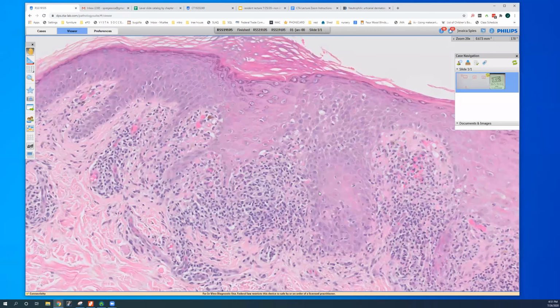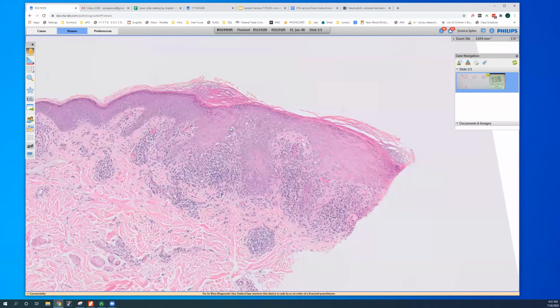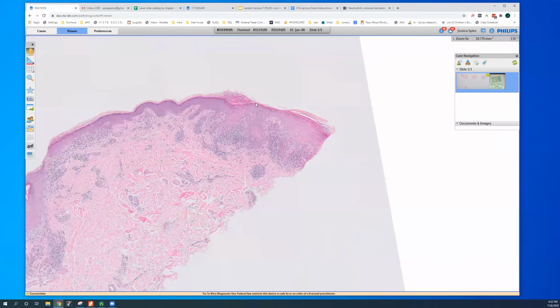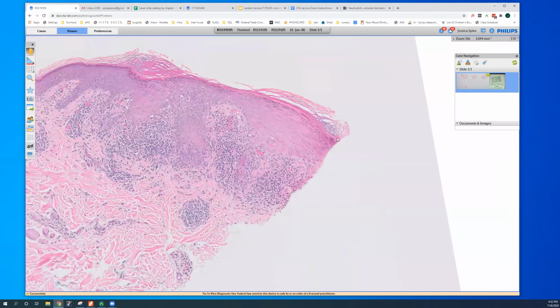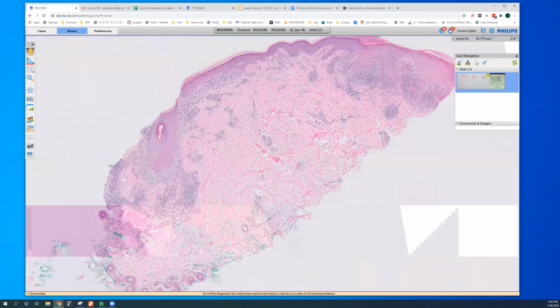Yeah, exactly, lichenoid. So here, we've got, I guess you could call it pseudovacuolar change, but then we've got necrotic keratinocytes, and we've got nice colloid bodies, these pink blobs. And we call these jagged rete. So this is a lichen planus pattern with the jagged rete, and then you have wedge-shaped hypergranulosis. Over here too, wedge-shaped hypergranulosis. Usually not much going on with stratum corneum.